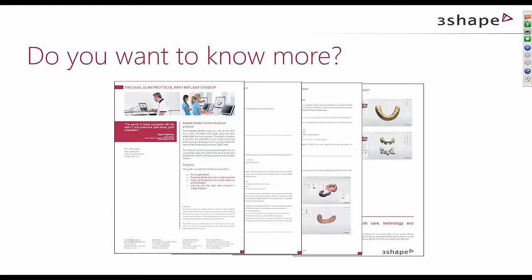Yes, please also be aware we have training videos on the dentist workflow available on YouTube. If you search for 3Shape Implant Studio Edentulous, you should find them. There are 5 of them. They dive even deeper into how to use the different tools available within the software. It's based on the 2015 version, so some of the things you saw today are not available, but even better, with 2016 you can do more. So I think we have covered all of it so far.